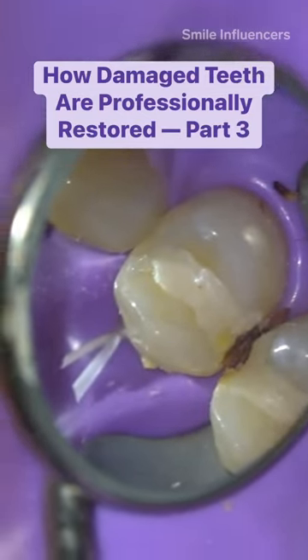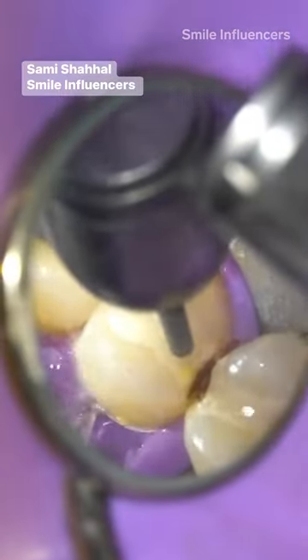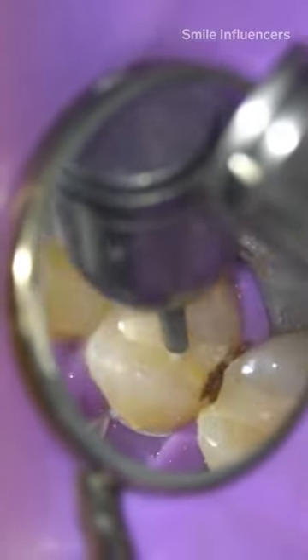This tooth has a broken filling with a large cavity developing between the filling and their natural tooth. In order to clean the decay out, I first have to remove the existing filling.